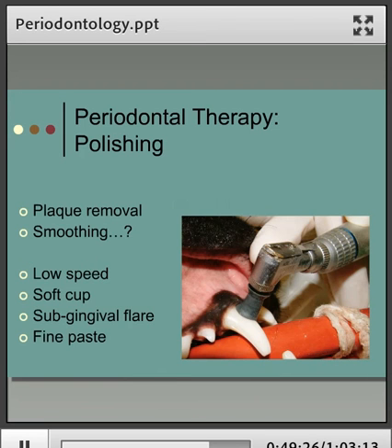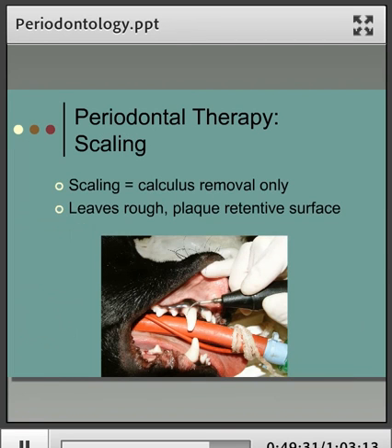And one of those things, of course, is to make sure that we never use the end of the tip on the tooth, so we don't use it like a ballpoint pen. We use the side of the tip, so we need it to be near the tip to be efficient, but not the end of the tip. And also that we only have it on the teeth for a very, very brief moment and work up and down the rows of teeth, gradually getting each one of them cleaner and cleaner. Don't try and get one tooth clean and then move on to the next one and try and get that clean.